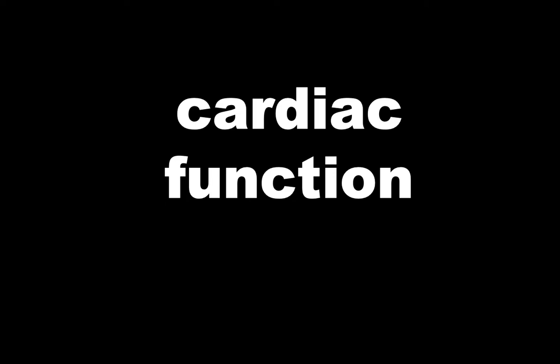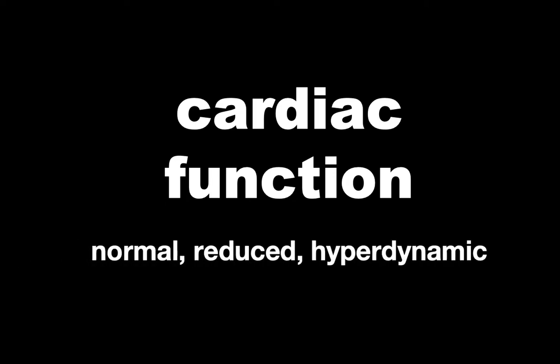So our job in the ED is to tease out if the function is normal, reduced, or hyperdynamic. It's not our job to tease out any valvular pathology or if the patient's ejection fraction is 45 versus 55%, but rather just a more global assessment of what the heart is doing.